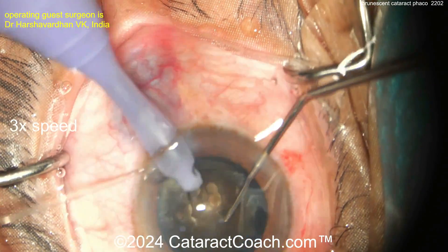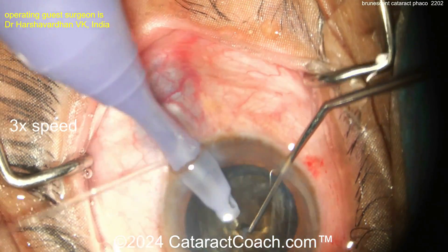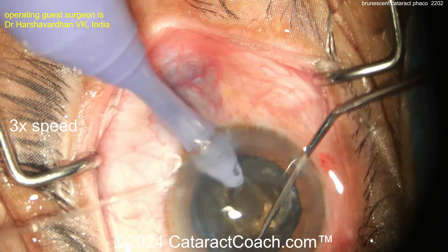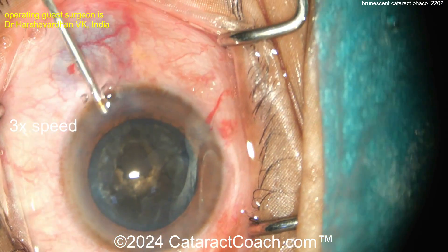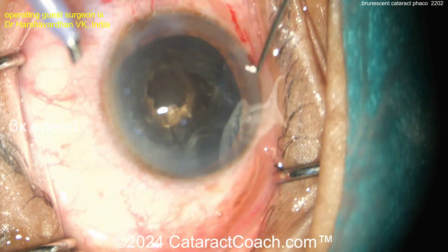Going in, making a little pit — maybe a pit technique — a little groove, getting nice and deep, then burying the probe in that pit like the submarine chop technique Mahanta showed us. Actually, let's go back to this video — more viscoelastic.